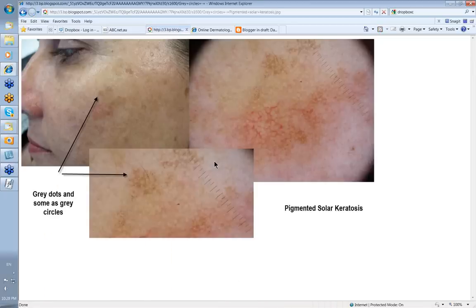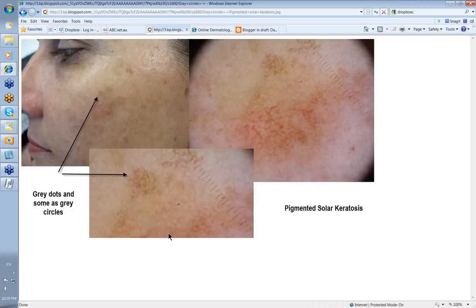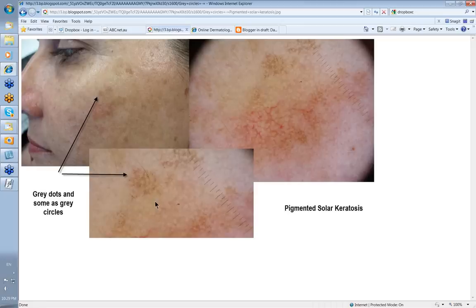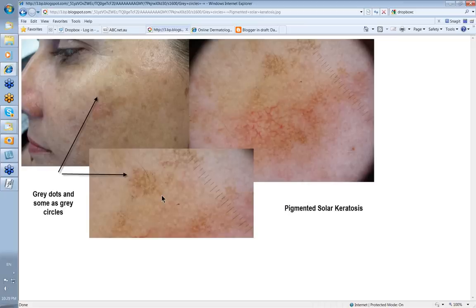Still talking about grey circles — remember: lichen planus-like keratosis, pigmented solar keratosis, pigmented IEC, and lentigo maligna. This is a diffuse lesion on a lady's cheek, slightly red here, slightly pigmented here. When we look at it with the dermatoscope, there are some fine grey circles, and there are grey dots making up the appearance of a circle around the opening of the hair follicle. In this case, histology showed it was just a pigmented solar keratosis. You can see the difficulty, even dermatoscopically, of separating out pigmented solar keratosis, pigmented IEC, lentigo maligna, and LPLK.